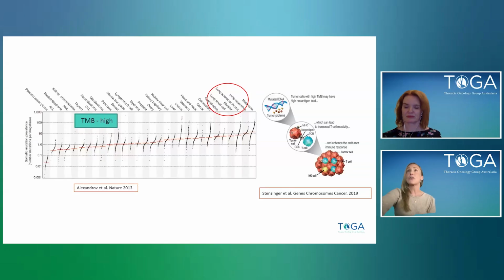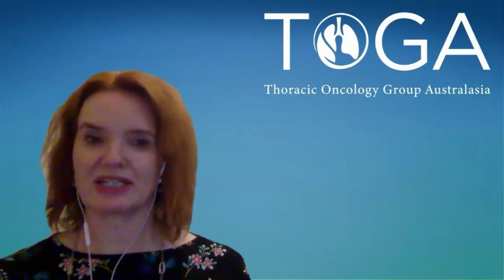And there's different categories of TMB. TMB above 10 is associated with a few FDA approvals and is used generally to indicate high tumour mutational burden. But I will say there's a bit of work going into trying to make that more specific to tumour type, as not every tumour type should probably have a cutoff of 10. And this was an ultra-mutated tumour, which is generally a word associated with tumour mutational burden over 100. So this is 120-something.